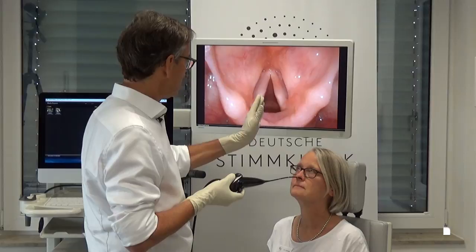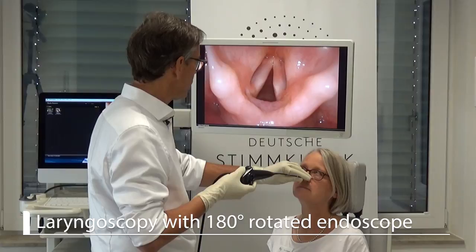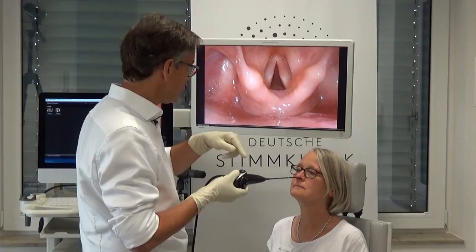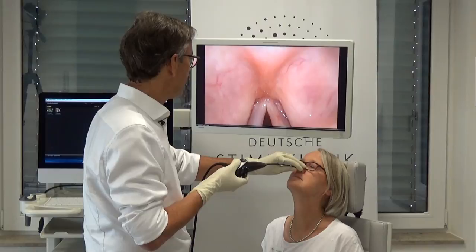I want to come into the larynx straight from the back — that's the best position. I don't want to touch the arytenoid on the medial aspect on either side. That's why we have to learn with the rotation maneuver to also turn the head. Let's see what happens when she over-extends the neck — inhale.